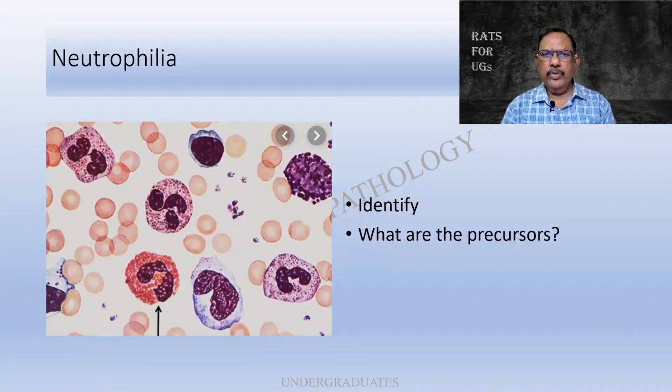The next diagnosis that we are going to see is neutrophilia. Simple slides will be given to you. The neutrophil is identified by means of the fine granules which are almost colorless. Eosinophil, large brick red, and basophil, coarse blue overlapping the nucleus.